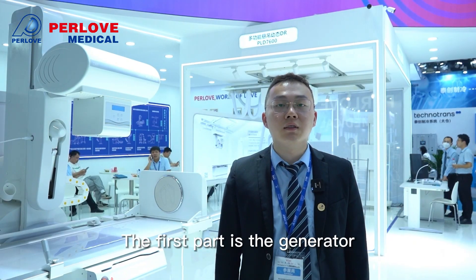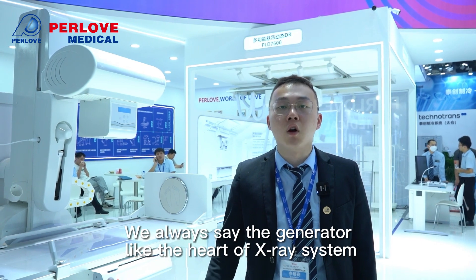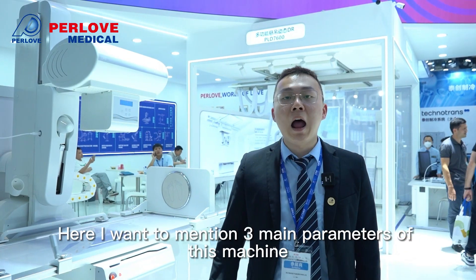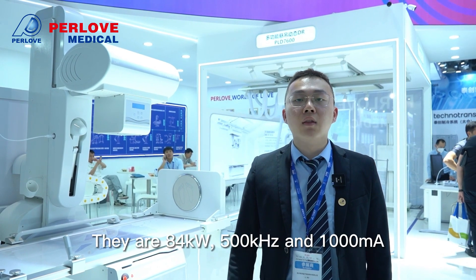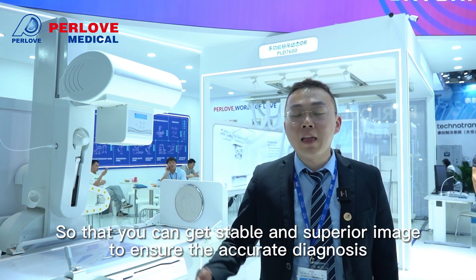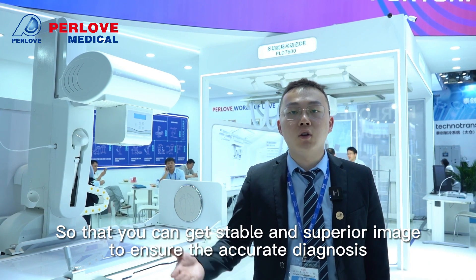The first part is the generator, which is 100% produced by ourselves. We always say the generator is like the heart of the X-ray system, and not all Chinese companies have such R&D strength. As the source of X-ray, the three main parameters of this machine are 84 kW, 500 kHz, and 1000 mA. The high output power and inverter frequency ensure good X-ray source quality, so you can get stable and superior images for accurate diagnosis.